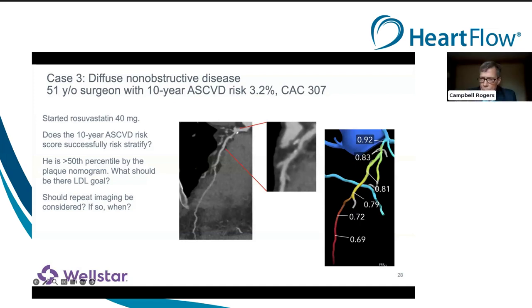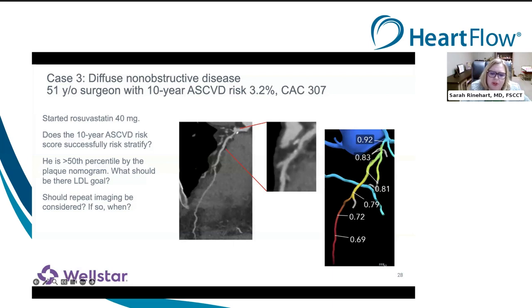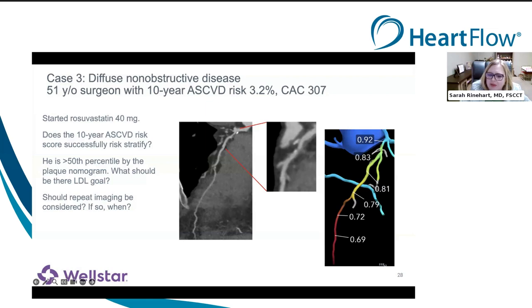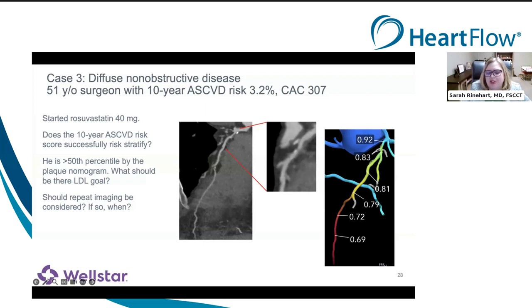In reporting this, I would say there's a slow decline in FFR value without a specific focal pressure drop, which is likely consistent with mild to moderate disease. I agree with that. Sometimes I report the delta — it's very borderline, and there is complex plaque. The concepts are the same: sometimes I'll say the likely reason for the distal FFR is sequential lesions that are more moderate. Whenever I see an FFR drop like that, I always call the referring physician personally and say this patient needs to be watched closely.